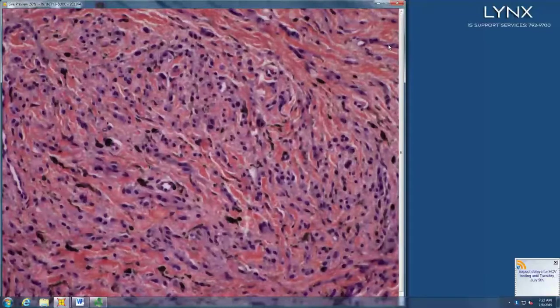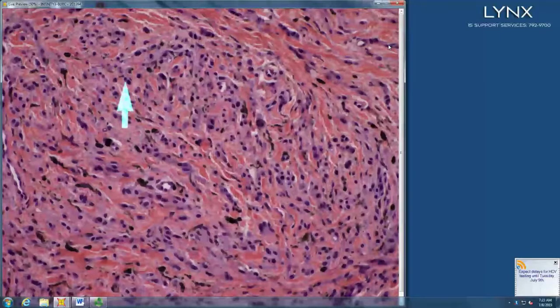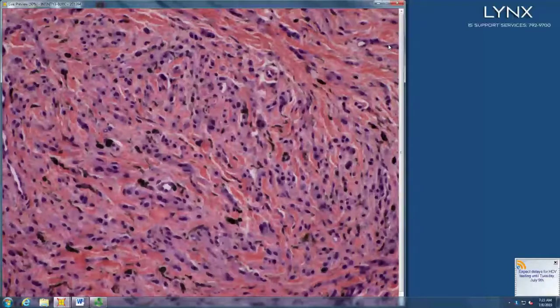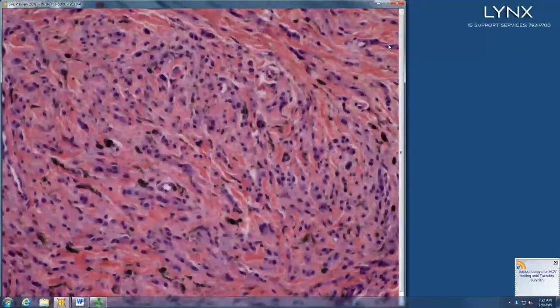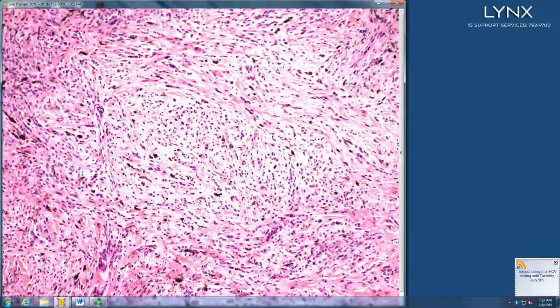A single population of melanocytes or a mix of small and larger melanocytes? Clue, it's always the second choice. So mix of small and larger. You have two populations mixed together.